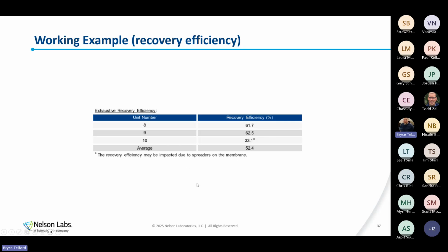There are things we can do, such as getting a bigger statistical base, but even if we're choosing not to take action, the validation is the point when you should write and have some rationale about why this recovery efficiency is okay. But generally speaking, you're going to do that once, during the validation, for example. If it hasn't been done during the validation, now's the time to go back and look. But generally, you're going to do that once, and that's going to be your assessment. And you're really not going to assess it again unless there's a change to the product.